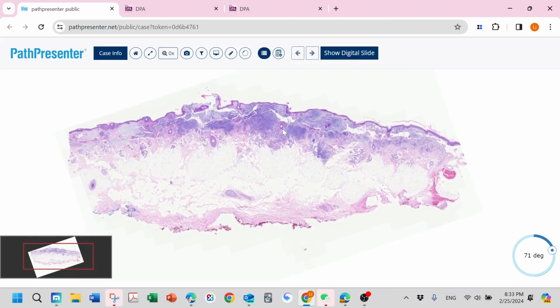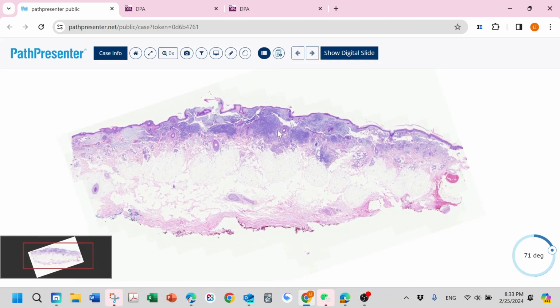And then whenever you see this big, wide excisional sample, you can kind of cheat. It should be malignancy. If not malignancy, usually you won't get this big chunk of excisional sample. Then you can see hair follicles go down deep into the subcutaneous tissue, so it should be from the scalp.